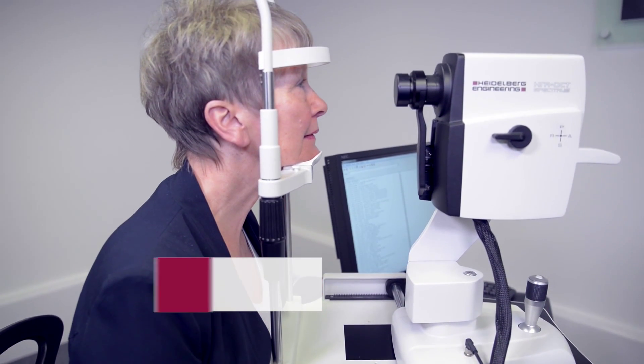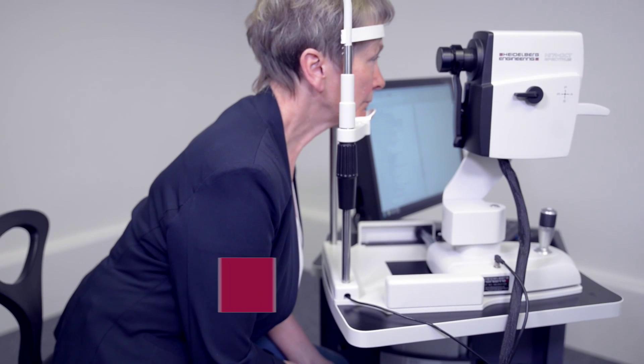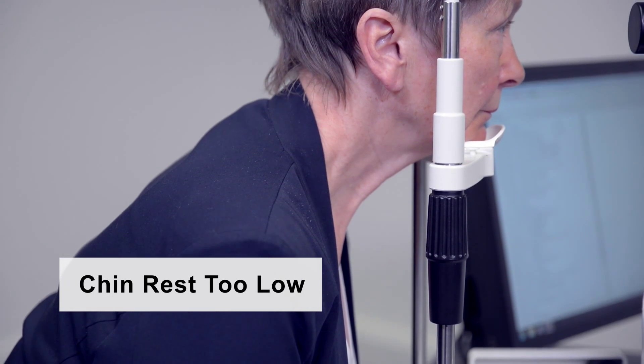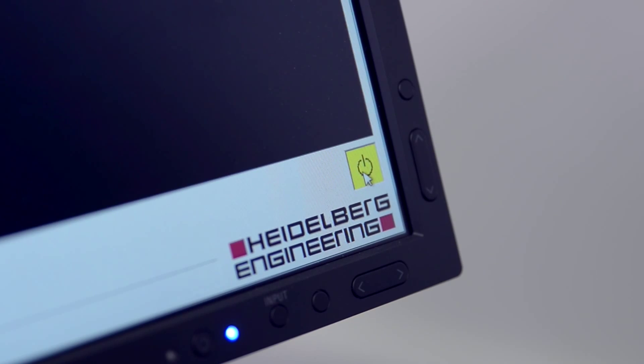If the patient is incorrectly positioned you may encounter difficulties during image acquisition, as the distance between the camera head and the eye may be too great. Also, if the patient is incorrectly positioned they may experience some discomfort during the examination. You are then ready to start acquiring images.